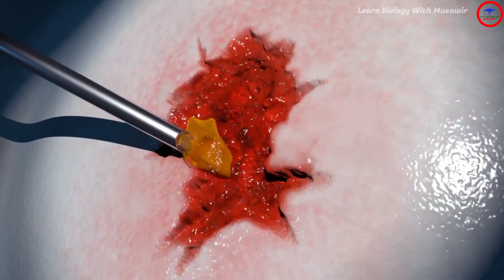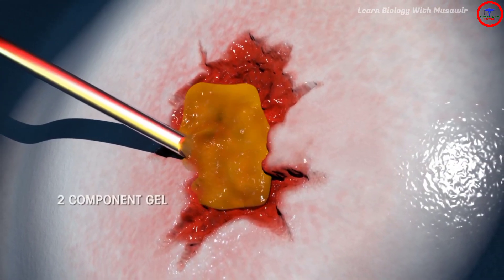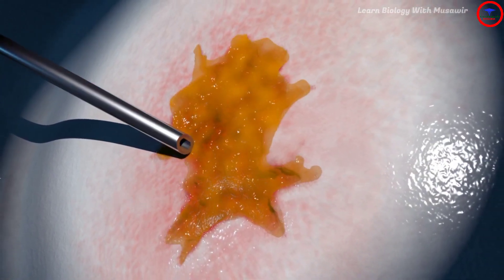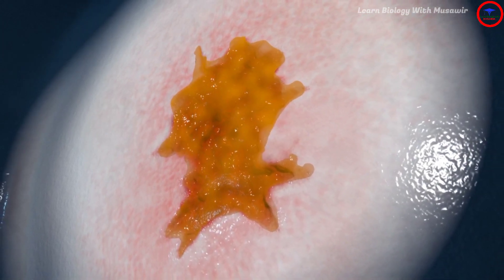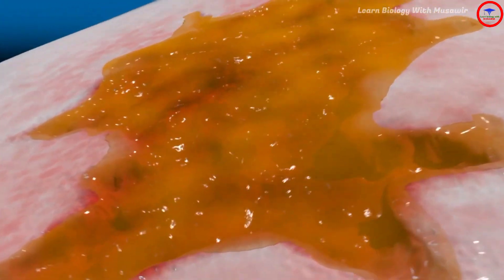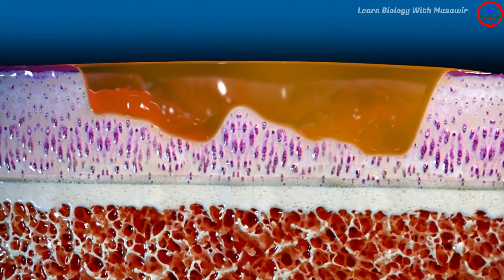The injectable plaster can best be compared with a two-component glue. It consists of a mixture of natural polymers and a cross-linking agent. Initially, the plaster is fluidic, which ensures complete filling of the defect.